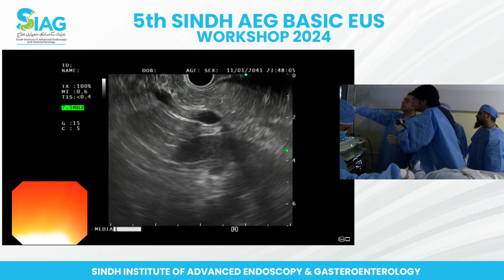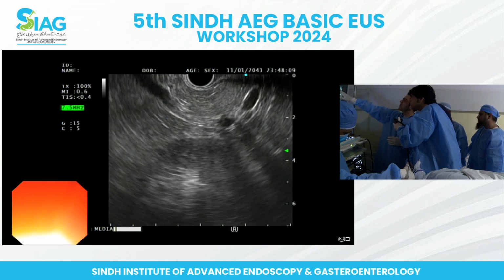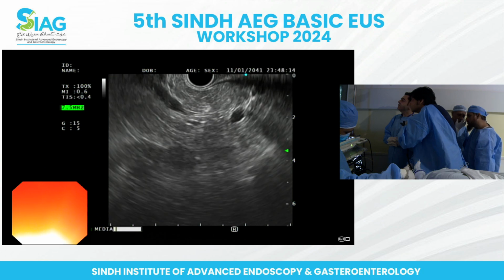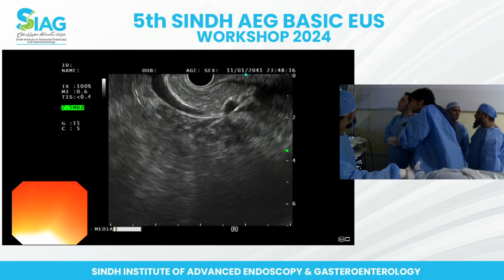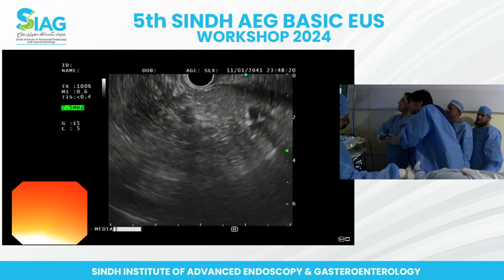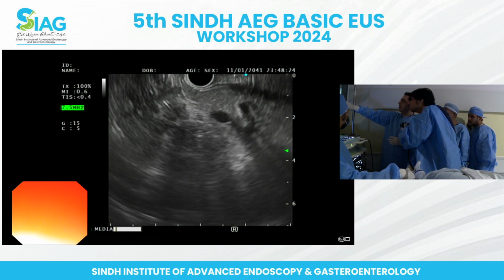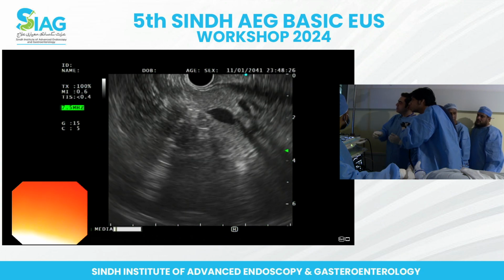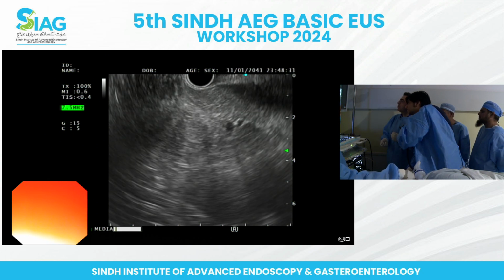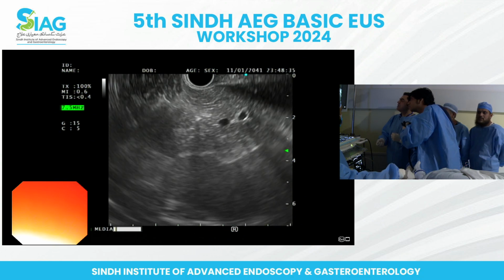Yeah, so you've got the left kidney coming in view, so follow this vessel, yeah, excellent. So you've reached the tail bit now. Now see if you can trace the vessels all the way to the hilum. Yeah, excellent. So the splenic artery is on the top, the splenic vein is below here, and you're reaching the splenic hilum. If you continue going, you can take it all the way into the hilum of the spleen, okay? Excellent. Now see if you can trace it back all the way.